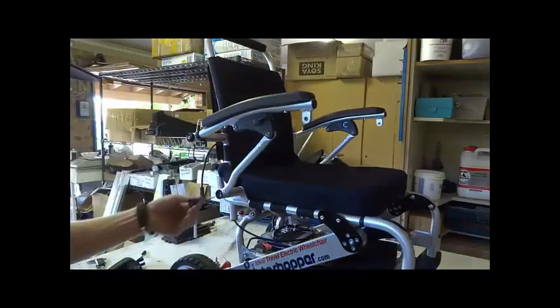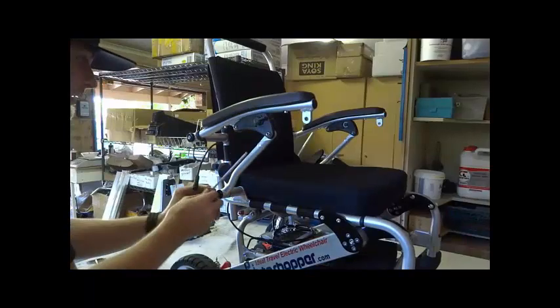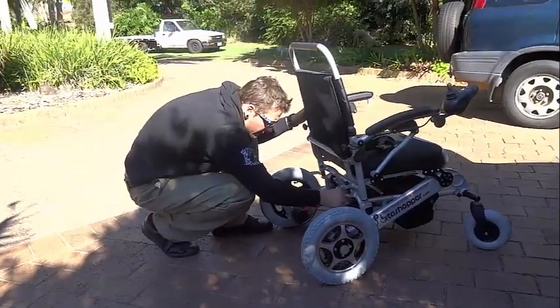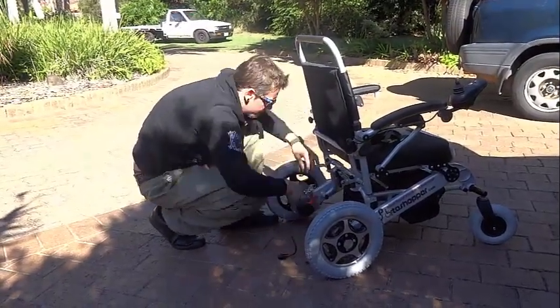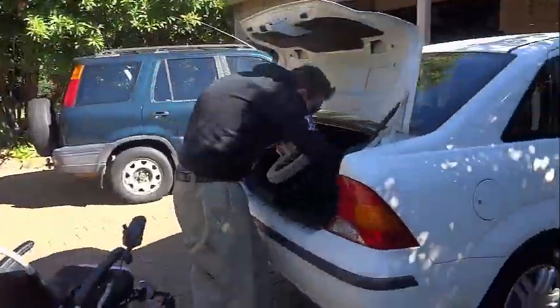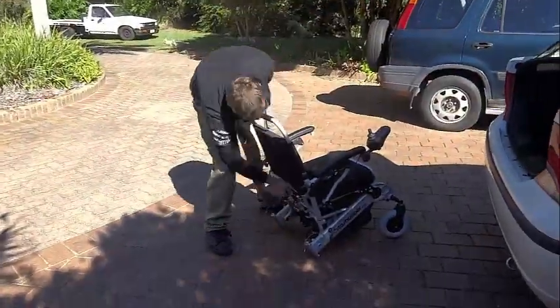The back wheel motors weigh 4.6kg or 10lbs each, and once detached by means of the Big Easy Kit, the frame weighs 16.7kg or 36lbs. The whole wheelchair weighs 26kg or 57lbs with the motors attached.